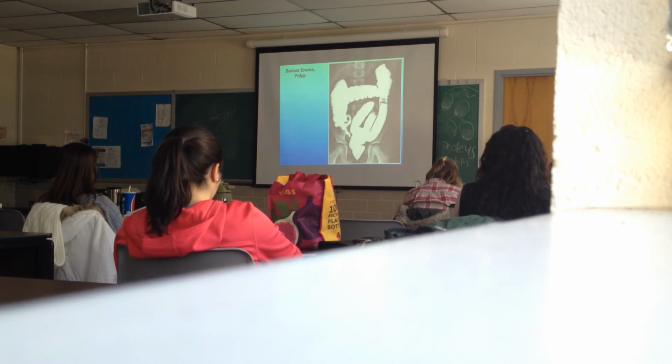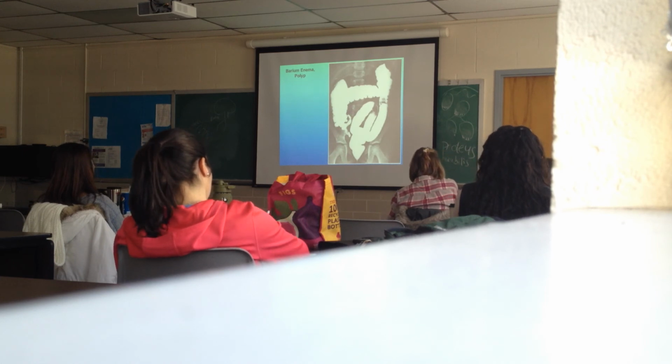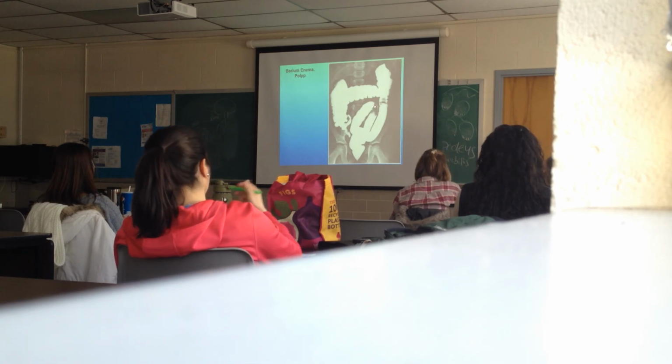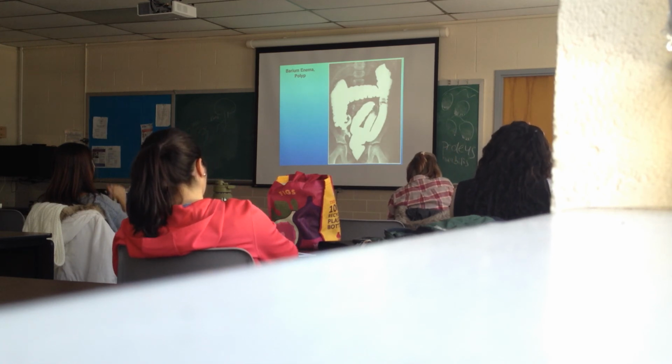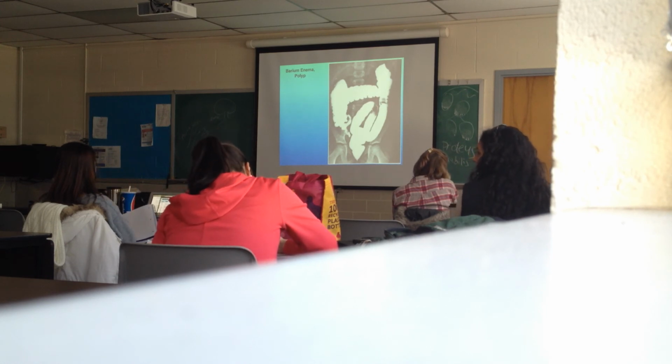And this little thing? Appendix. And this? The wall. What's this? Gas. This is gas. This is air.